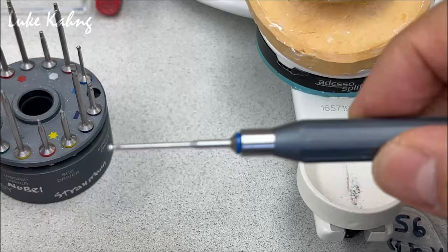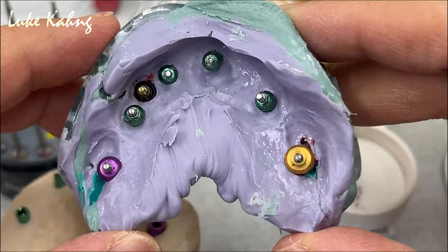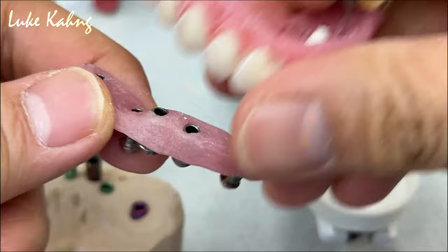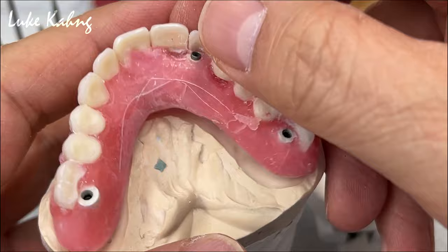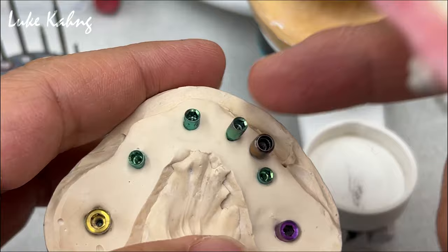Anyway, from this stage, we made the bite block. The doctor can send us the file so they can know if they made it temporarily, just like a wax trial or PMMA. So we fabricated the verification jig previously, and then we see the passive fit, and then we can send it to the doctor. If it's not fitting well, the doctor has to cut it, and then we glue it. And then we can re-verify the model and send it out again. So this is a prototype, and then we let them know, and the doctor would like to see our design, which we did. We saw that, and then we just finalize it from here.